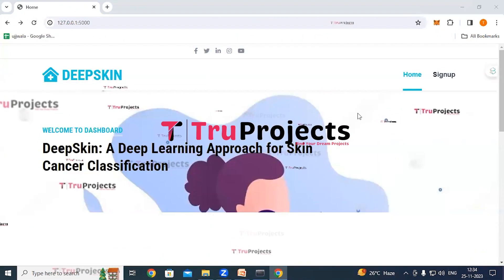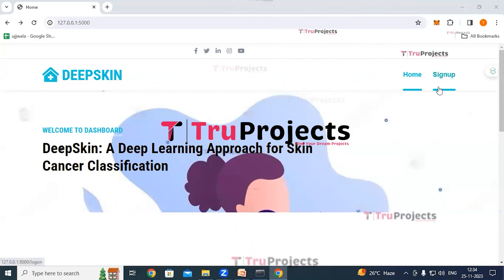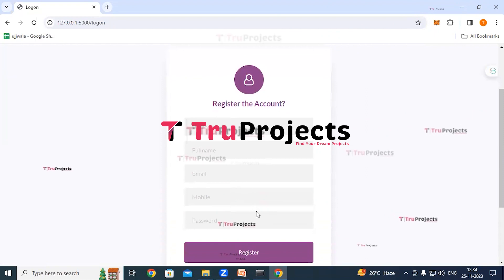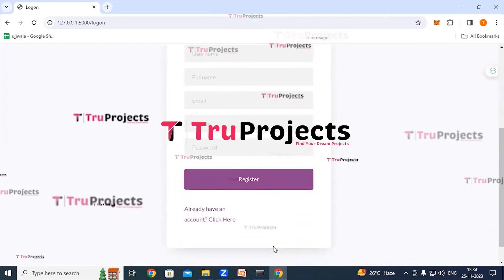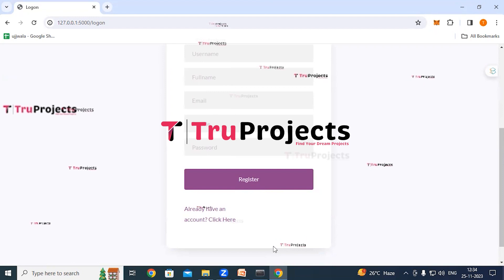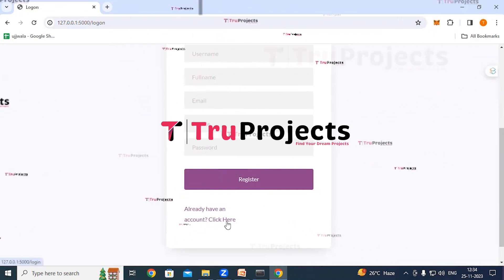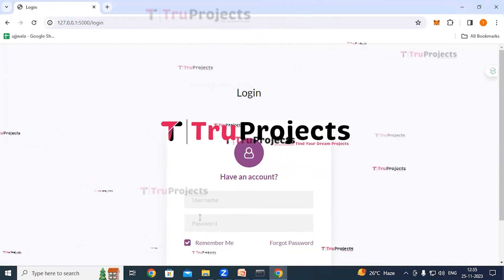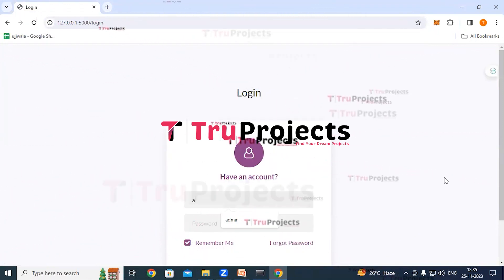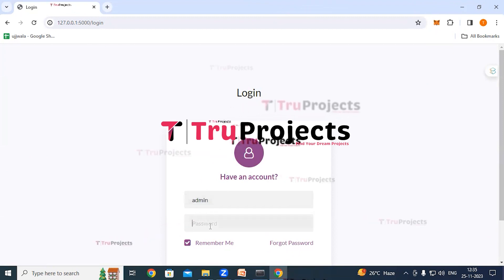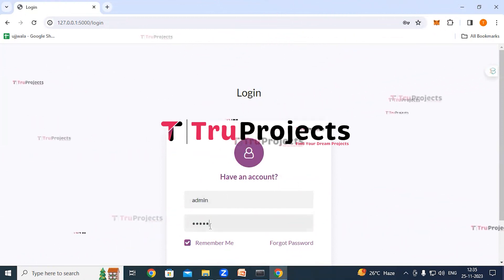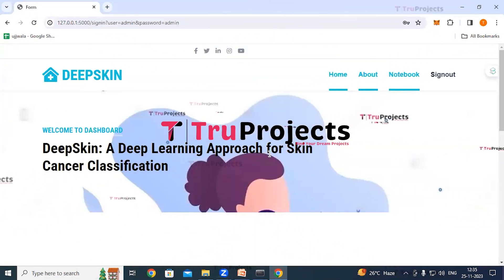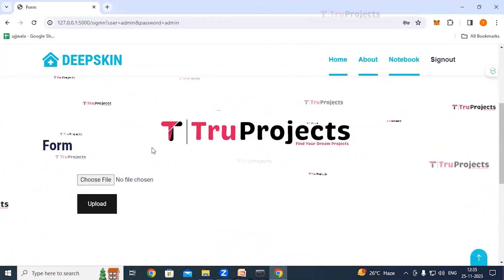The home page of the project is displayed, built using the Flask framework. There is a sign-up link for new users who need to register first by filling in their details and clicking the register button. Existing users can log in directly by providing their credentials, username and password, and clicking the login button, which redirects to the skin cancer classification page.